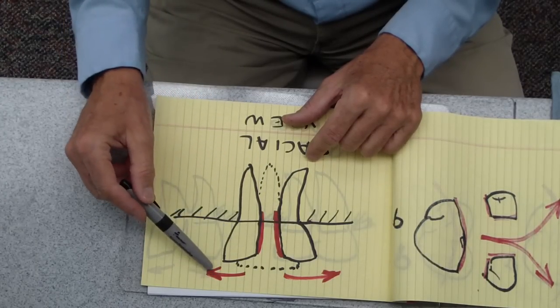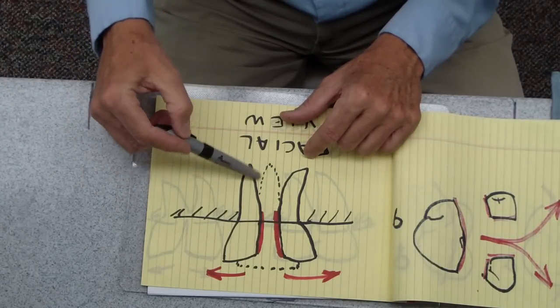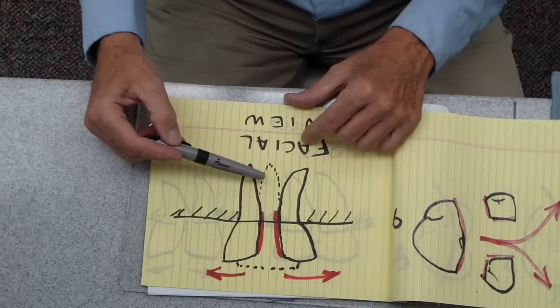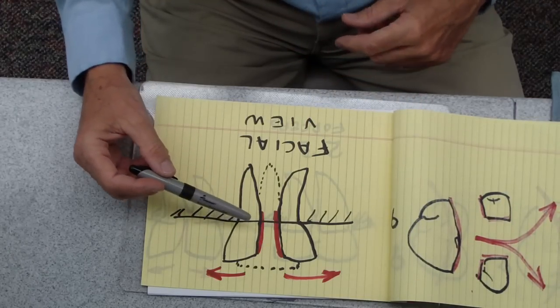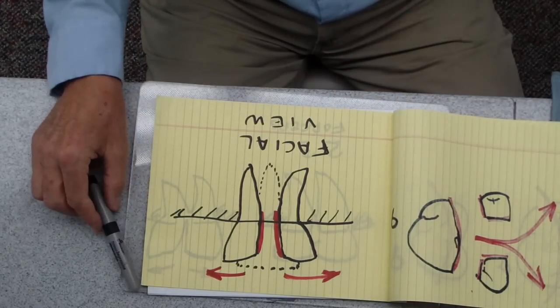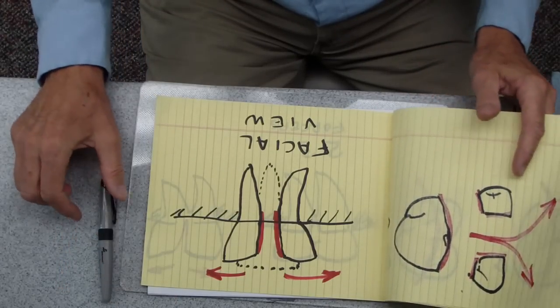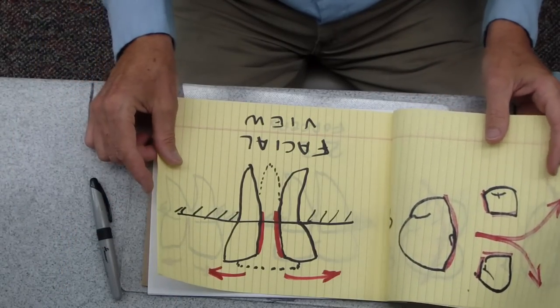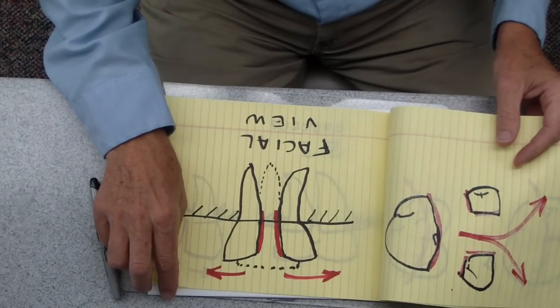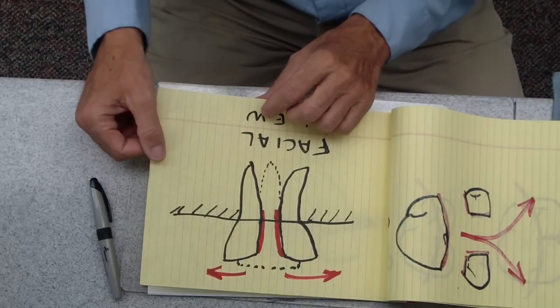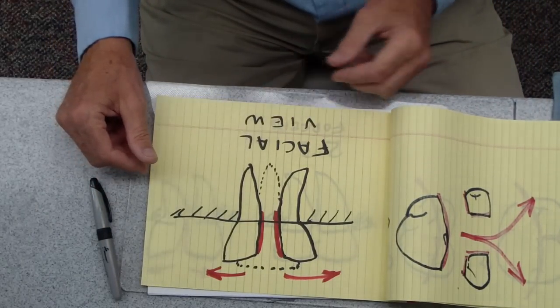Since they've got single roots on them, they're pretty easy to elevate. Then you're just looking at that dotted line there - that's the palatal root. Again, you can use an elevator or, with a little 6-9 forceps, grab that and take that out. That way you don't have to dig around for root tips on the buccal side. It just seems to work a little better in my hands. And of course, every tooth is an individual, so learn both techniques and use the technique that works best in your hands.